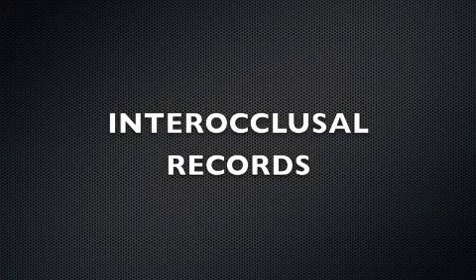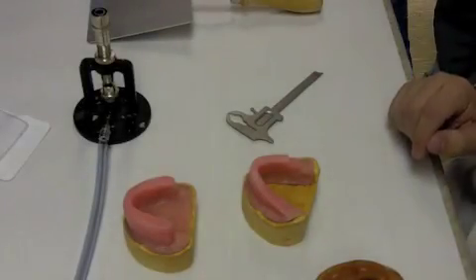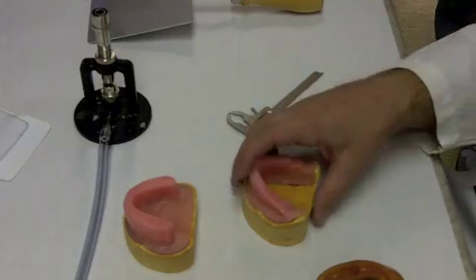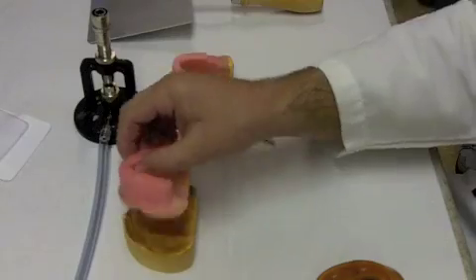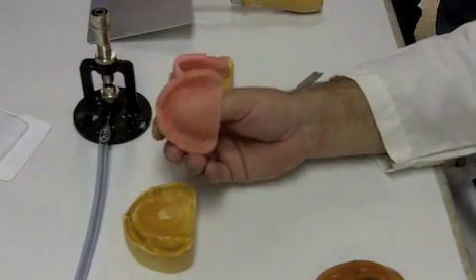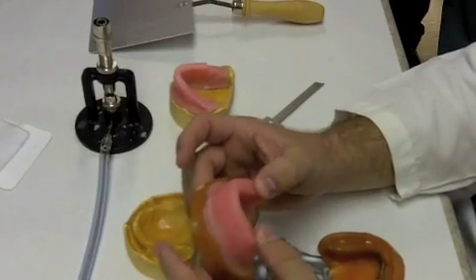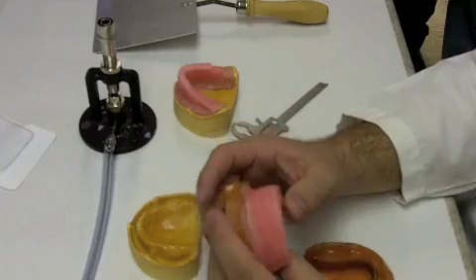Okay, here we go with interocclusal records. Now, we have adjusted our occlusal records, our record bases and wax rims, for, again, every patient. The record base and wax rim should be the same for every single patient. So now we want to go in and start modifying them.